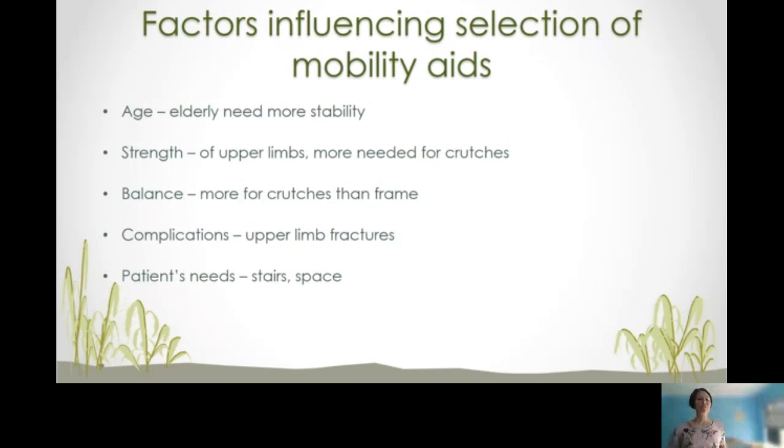Then there's the factor of space. How much space do they have to maneuver and walk through? How much space is there in a taxi they use as transport? All these factors influence the selection of the mobility aid.